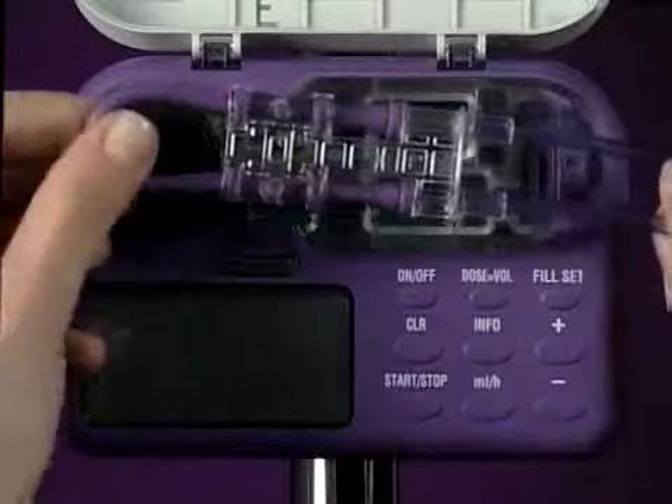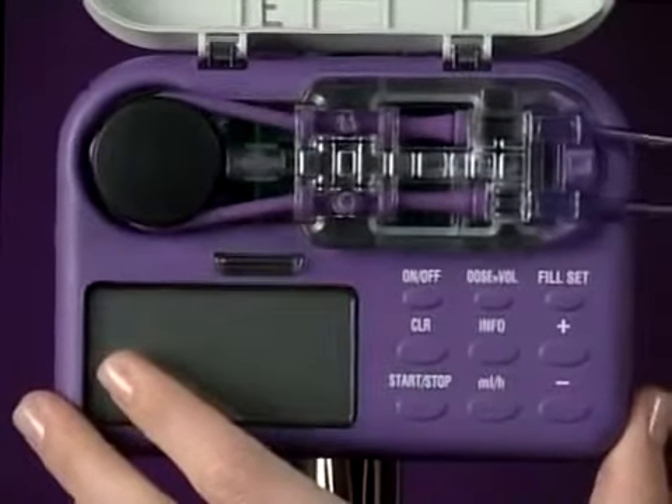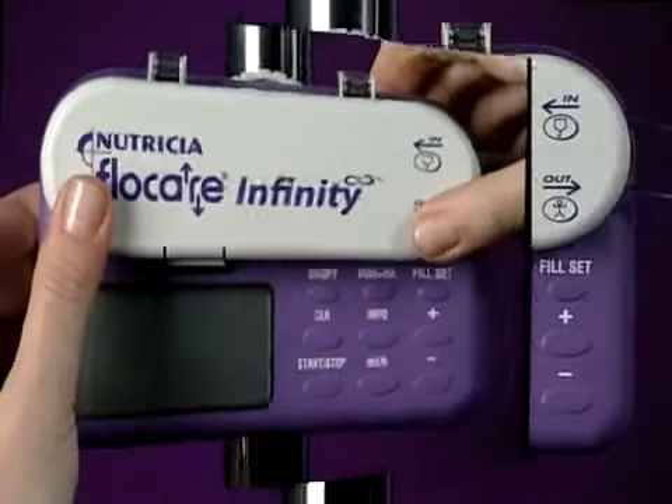Gently fit the flexible silicon loop of the pump insert over the pump rotor. Stretch the loop and seat the pump insert in the recess. Close the pump door with a click.